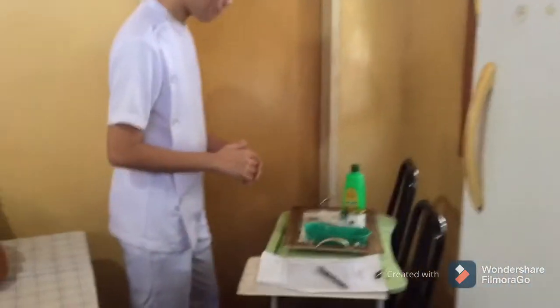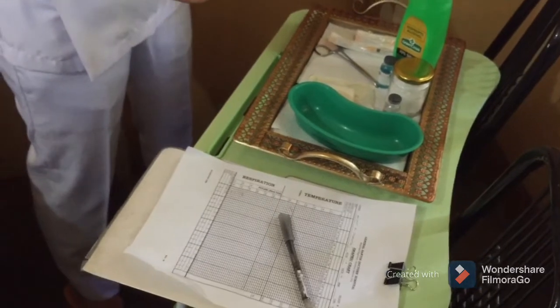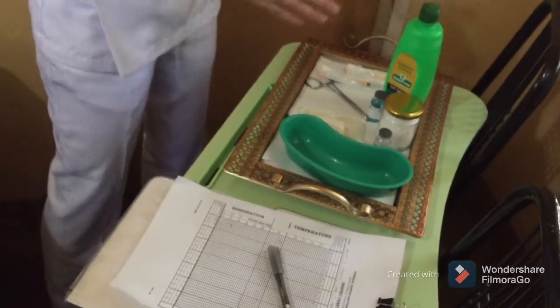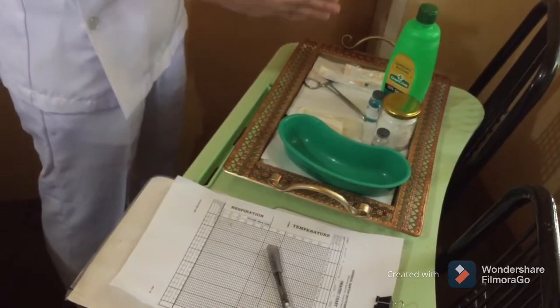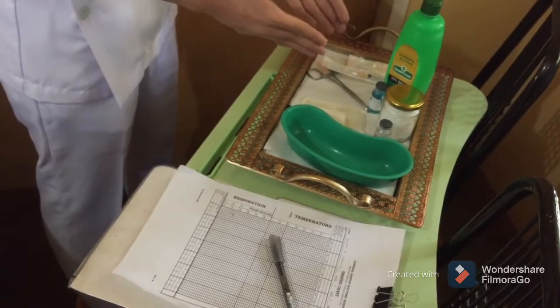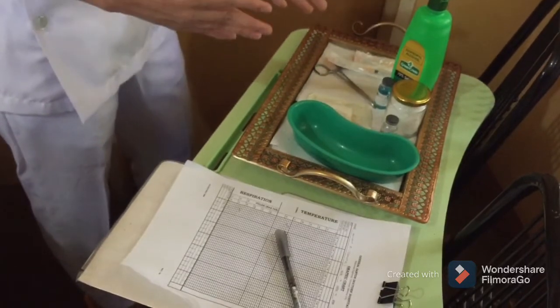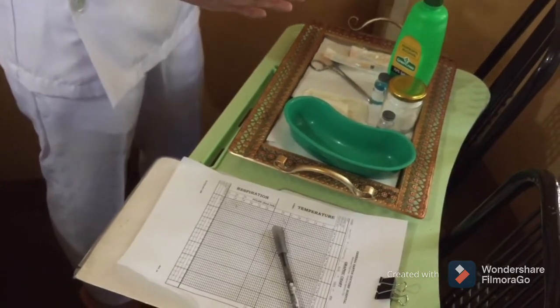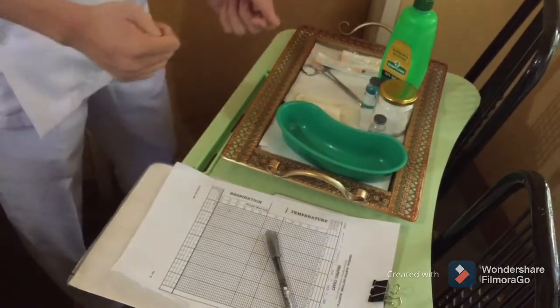After that, we are now going to assemble all the equipment and materials that we need. We have here a sterile syringe, one example is a tuberculin syringe, 1 mL, 1 cc. We have also alcohol for disinfection or hand hygiene. We have the vial of medication, the gauze, Band-Aid, epinephrine. We need to assemble these so that we are less likely to waste time and to avoid committing error.